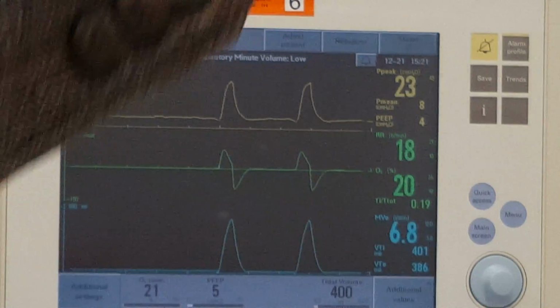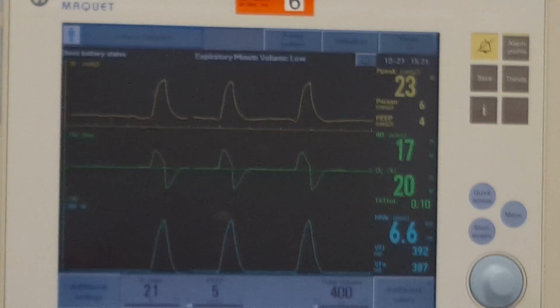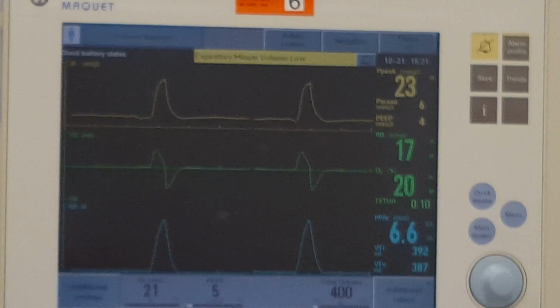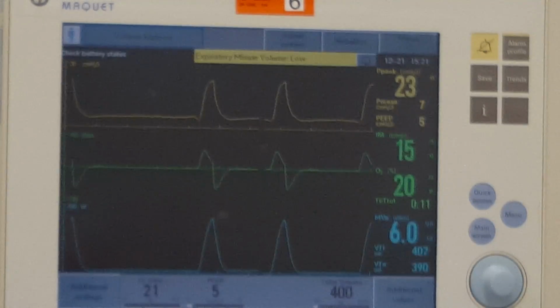And then over a number of breaths, as pressure titrated up, it was able to restore volume, but at the price of a much higher pressure. Delta P was 9 to begin with, 18, we halved compliance, so we needed double the amount of pressure to maintain volume.